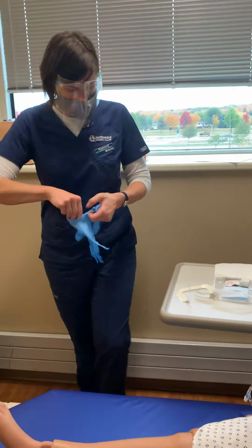I would grab a pen and I would initial and date my Tegaderm wrapper to note when it was last changed. And I'm going to put that right at the base just because with clothing going on and off, it's most likely that that's where it's going to pull up on the patient, so that just kind of reinforces it there. And as I had previously mentioned, there's no warmth here, there's no tenderness.